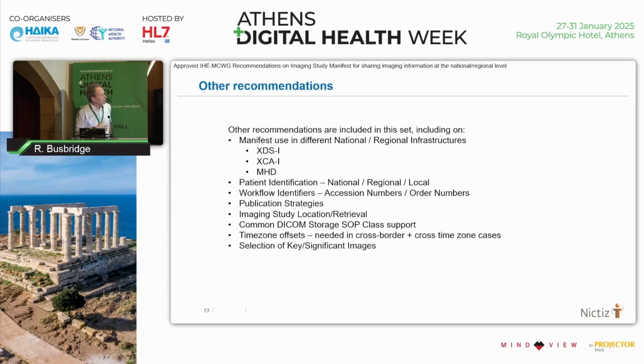There's also the time zone offsets, which Charles already mentioned. It's very important if an image is taken in one time zone that we can relate that to the time zone that we're actually working in. Oftentimes you find that the images created by the modalities don't take time zones into account. They just simply produce images. They will stamp them with the date and time that the images were created. But what we're saying here is that we recommend a time zone offset is added into the manifest that is applicable to all the underlying images. So you can actually use that to update your times in the underlying or referenced instances.